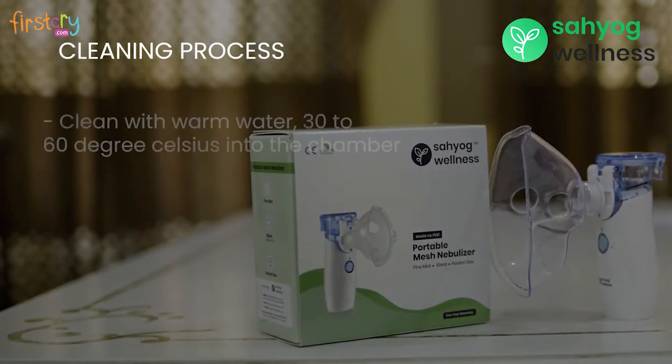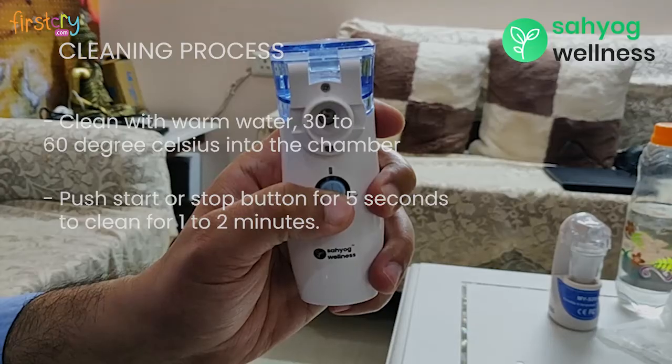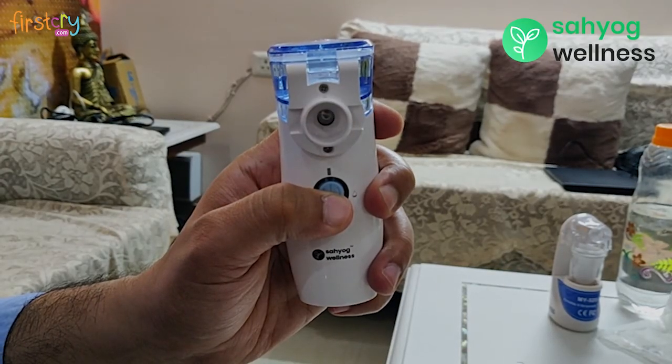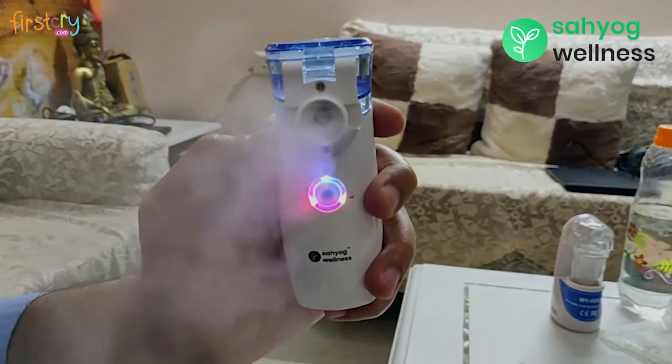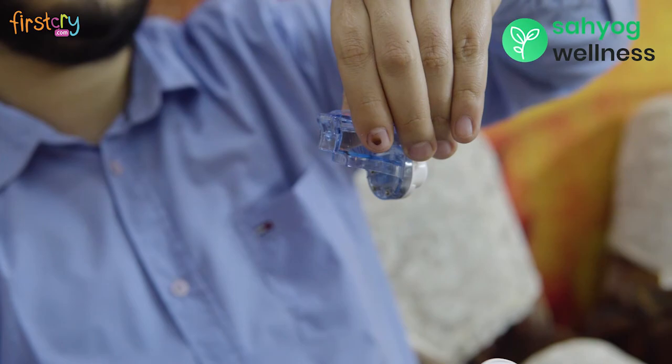For cleaning, pour some warm water into the chamber. Push the start or stop button for 5 seconds to clean for 1 to 2 minutes. Unmount the chamber by pressing the button behind the main unit while pulling out the chamber simultaneously.